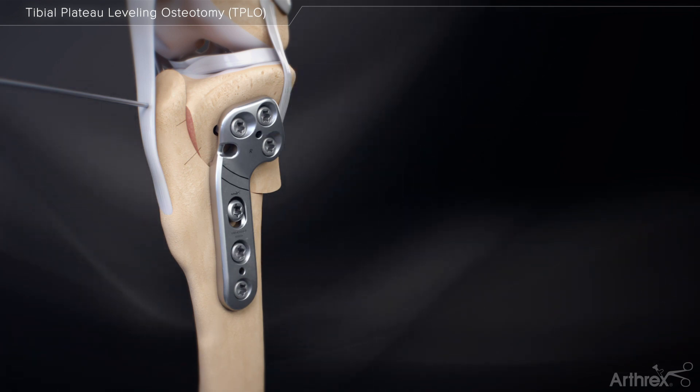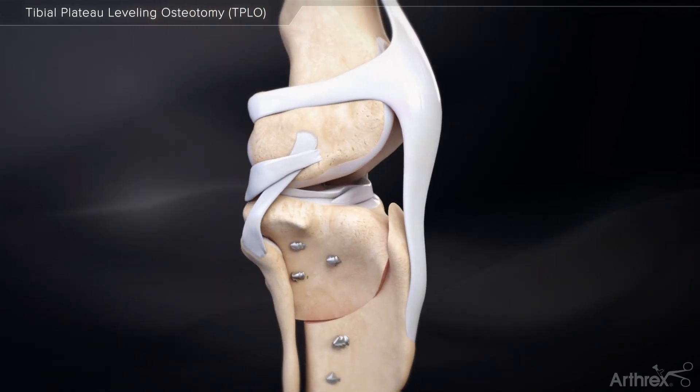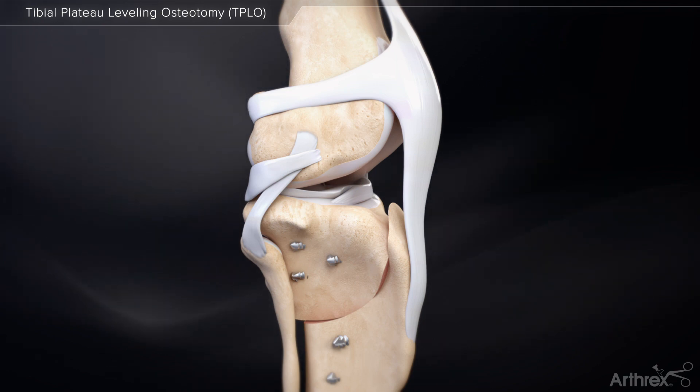Remove the jig and the remaining K-wires. An internal brace ligament augmentation may be necessary if the limb of the dog feels unstable after performing the TPLO.